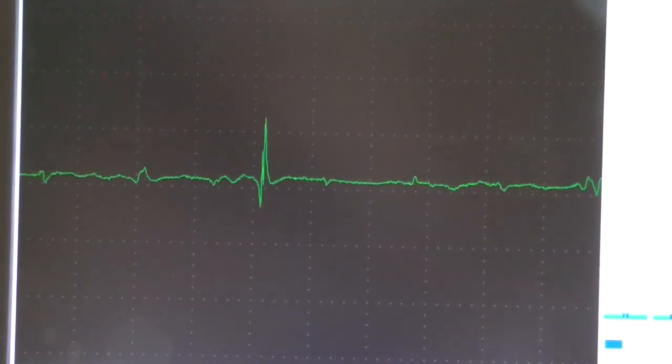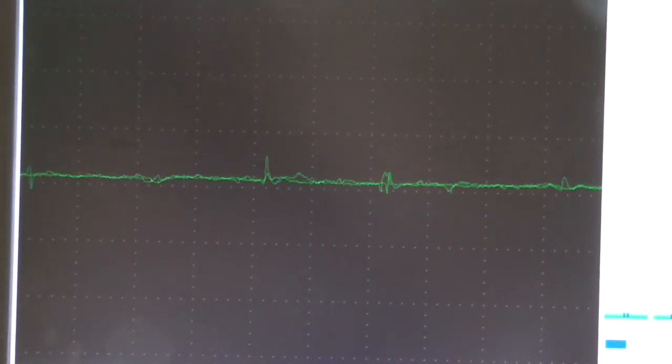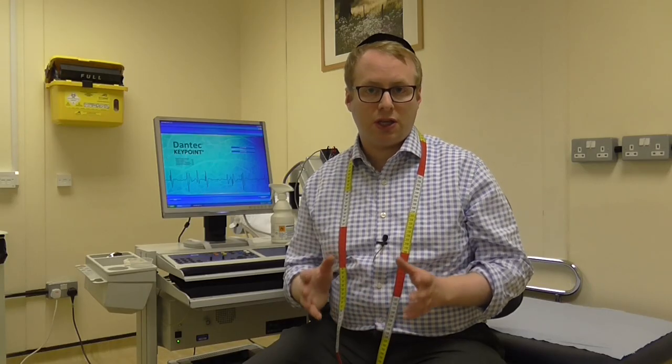These little tapping, popping sounds — these are all fibrillations. We can also detect fasciculations using the EMG. These are depolarisations of muscle fibres caused by activation of part or a whole motor unit. We differentiate these from voluntary activities by the activation rate, which will be less than 5 Hz.